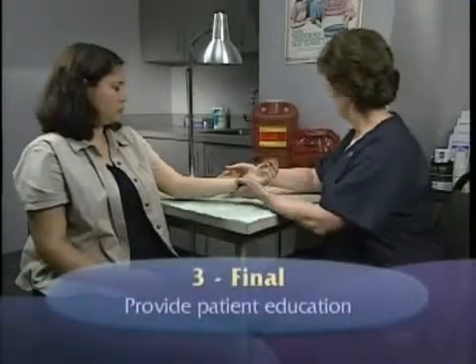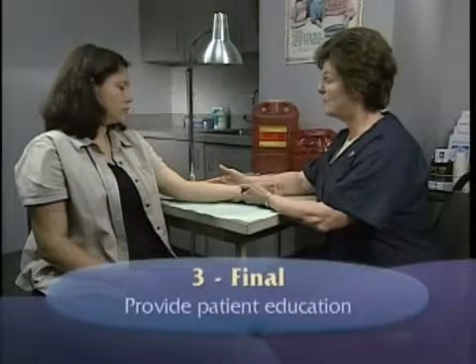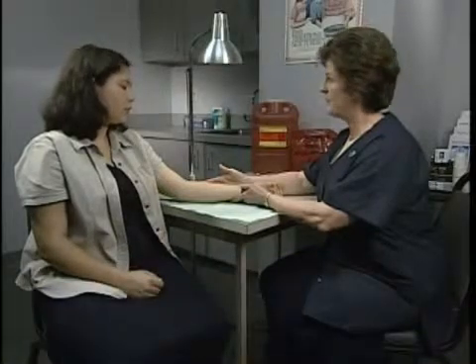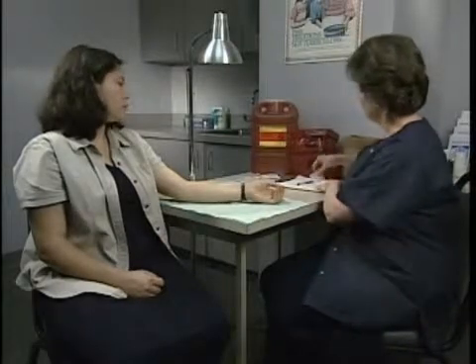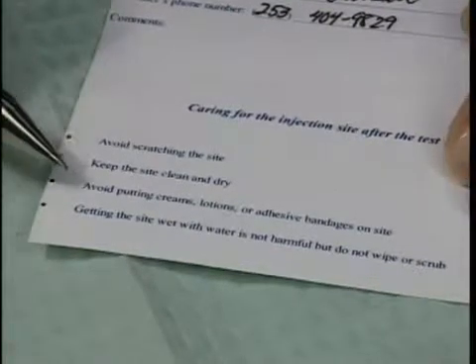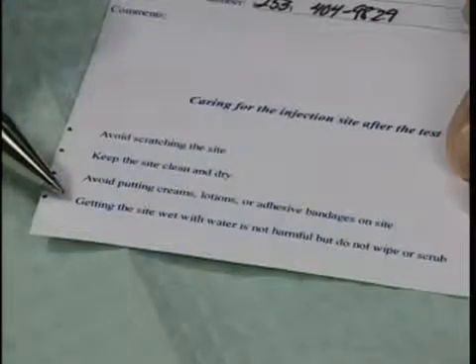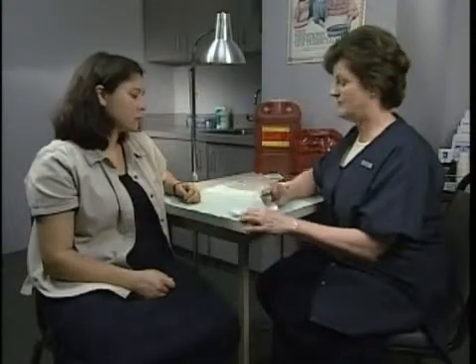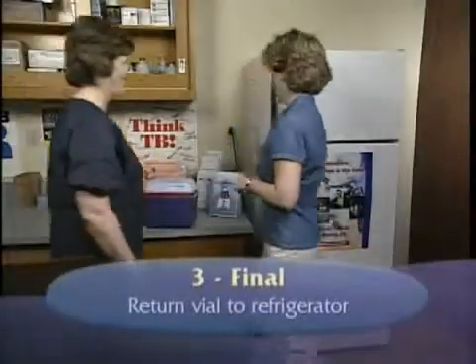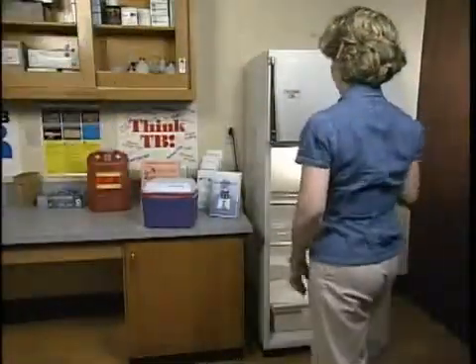Explain that mild itching, swelling, or irritation may occur, and that these are normal reactions that do not require any treatment. These types of reactions usually go away within a week. Explain how to care for the injection site after the test. Tell the patient to avoid scratching the site, keep the site clean and dry, and avoid putting creams, lotions, or adhesive bandages on it. Also mention that getting the site wet with water is not harmful, but the site should not be wiped or scrubbed. Finally, return the tuberculin vial to the refrigerator or other cooling container if you're in the field.